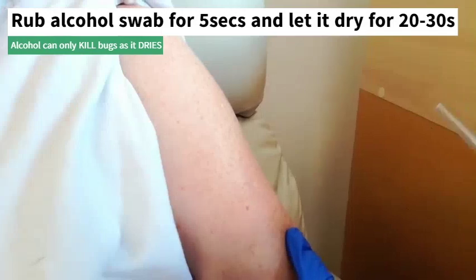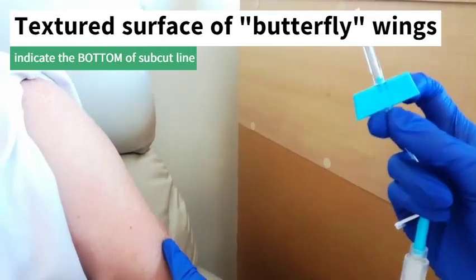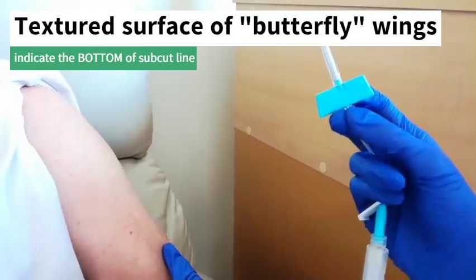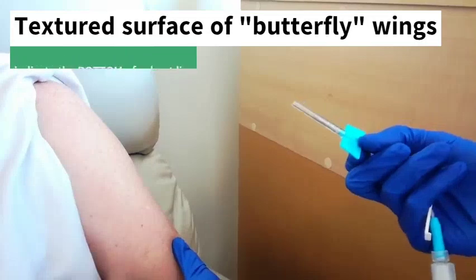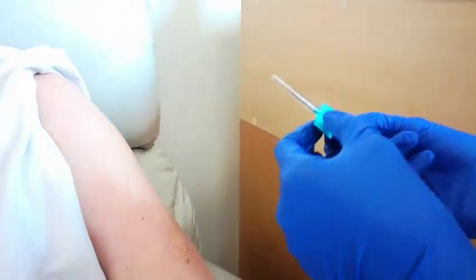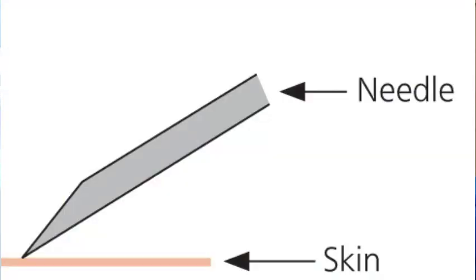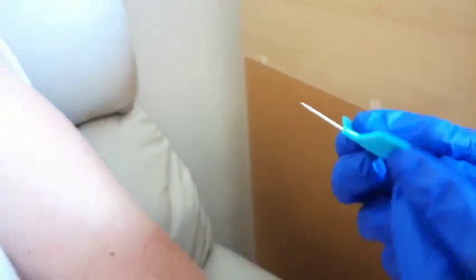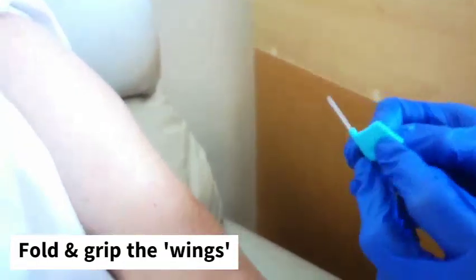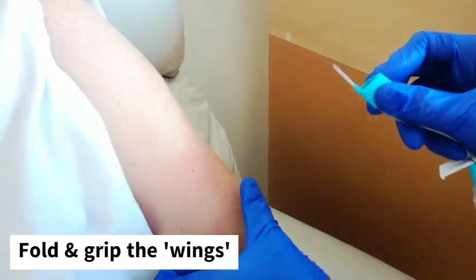When we prepare the subcutaneous line, you can see that on the butterfly, the blue section, there are some blobby bits — some rough bits. These rough bits indicate the bottom of the subcutaneous line. This is important because we need to have the needle the right way up. What this means is that when we take the cap off, we want the sharp and longest part of the needle at the bottom. The blobby bits are also at the bottom. So we hold it with the wings, holding onto the grippy bits, and we come back to the area that we've cleaned.